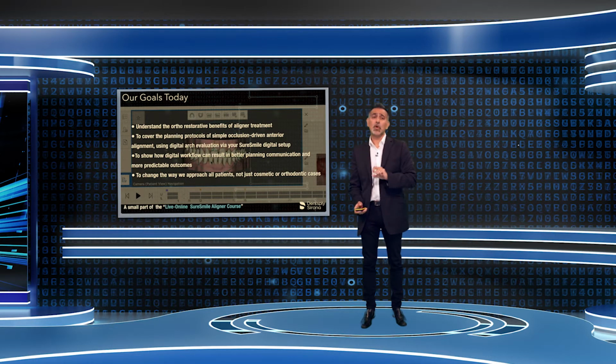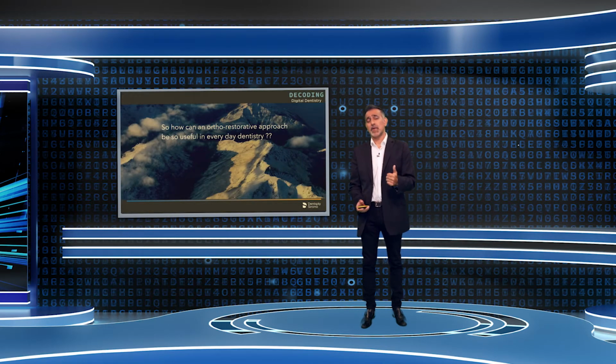And what you're watching is a small part of a live online SureSmile Aligner course. So my question now is, how can an ortho-restorative approach be so useful in everyday dentistry?